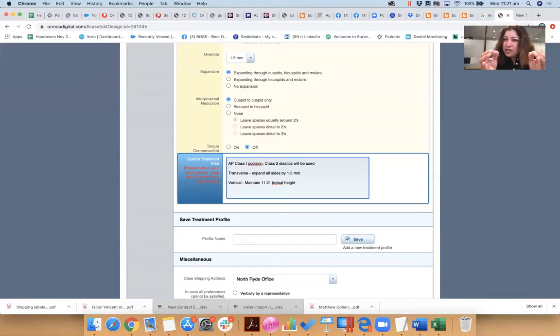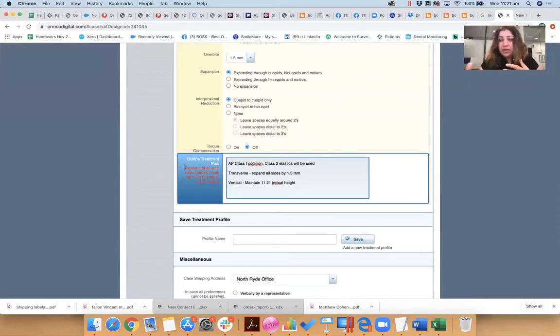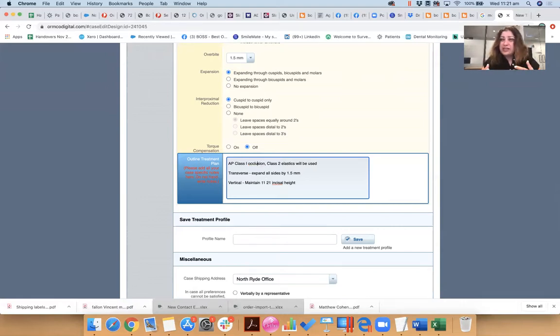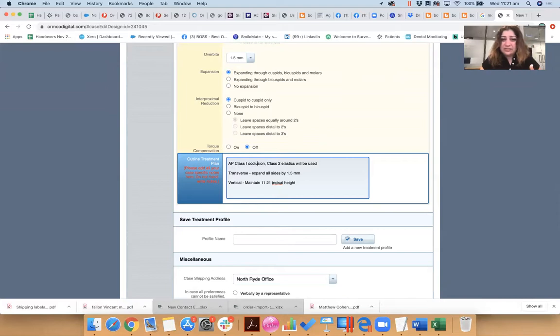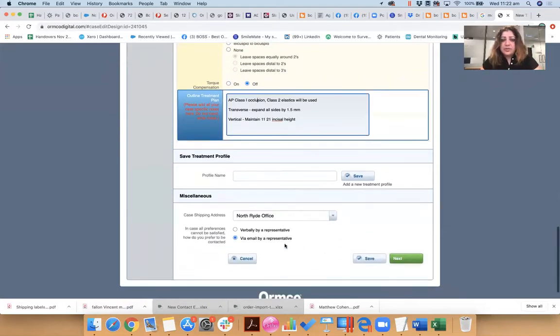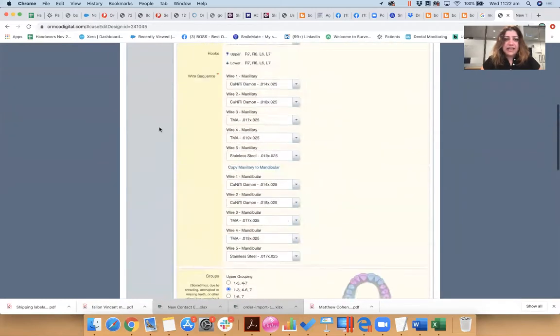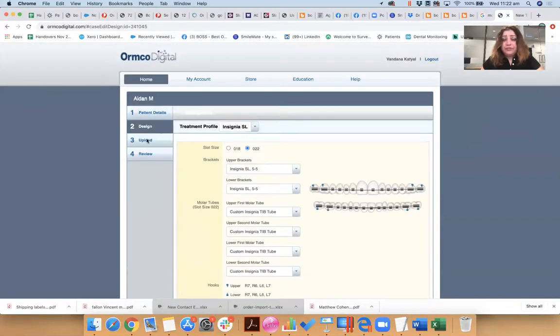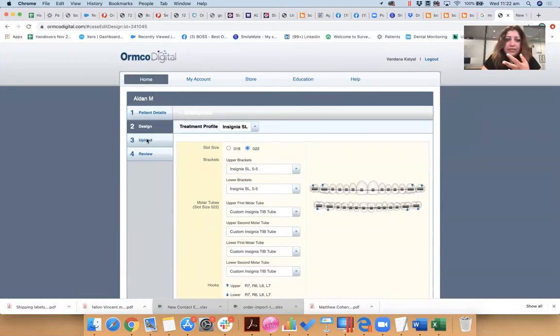And you might even tell them, you know, distalize my upper arch by one to two millimeters, mesialize my lower arch, or whether this happens biologically, we don't know. But the simulation at least can be created to the best level that you want to do. This is where you tell them, you know, and the next step is actually uploading your photographs, your STL files, and reviewing that and submitting the prescription.